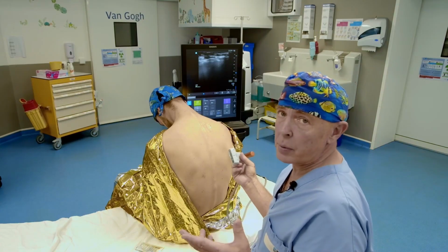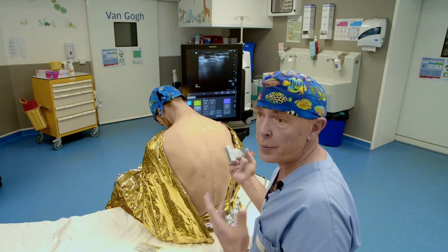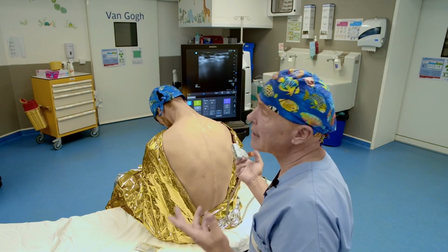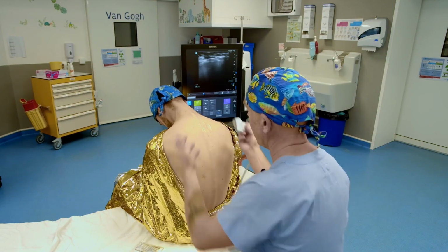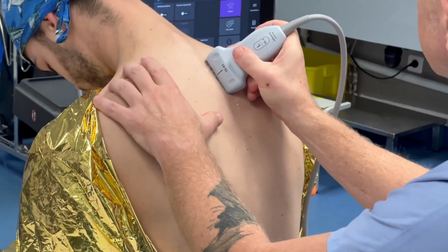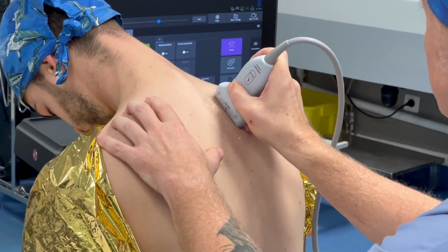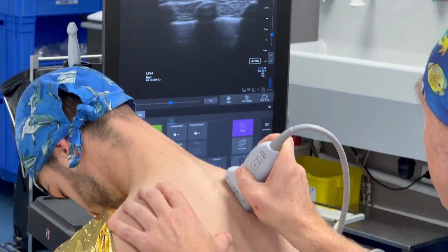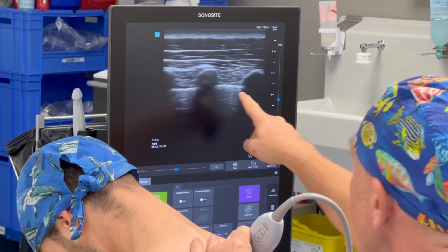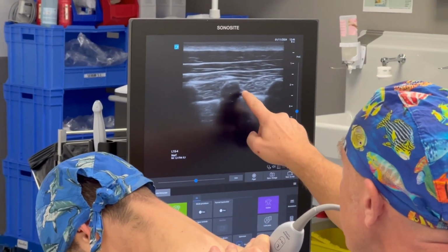Here it is, the last block in this series from the practical workshop, step number 4, the paravertebral block with its variation, the erector spinae block. So as I told you, I do it with the patient sitting, okay? And then so we move a little like this, and then we find the image. There you go. So here we have exactly the transverse processes. And you see, as I move a little, the pleura is here. And so the injection site for a paravertebral block is at this level.